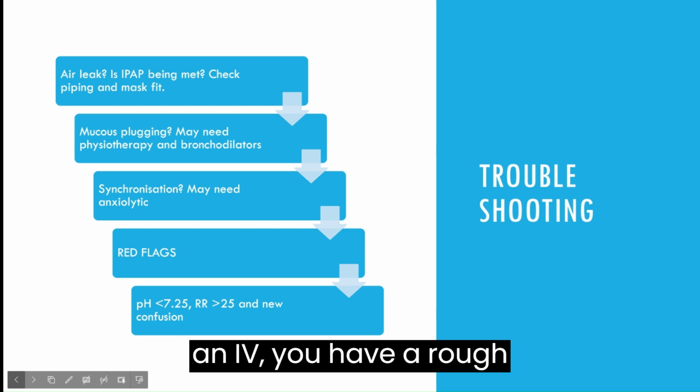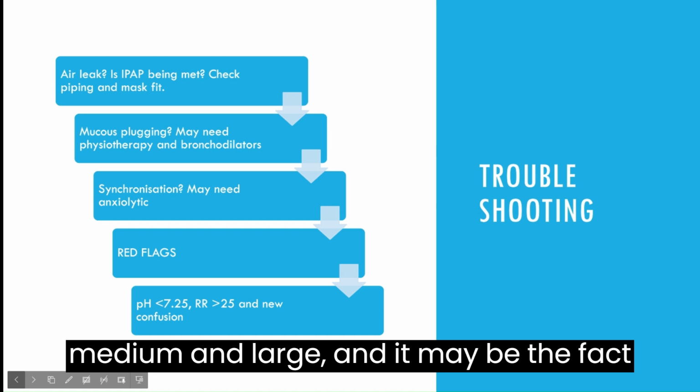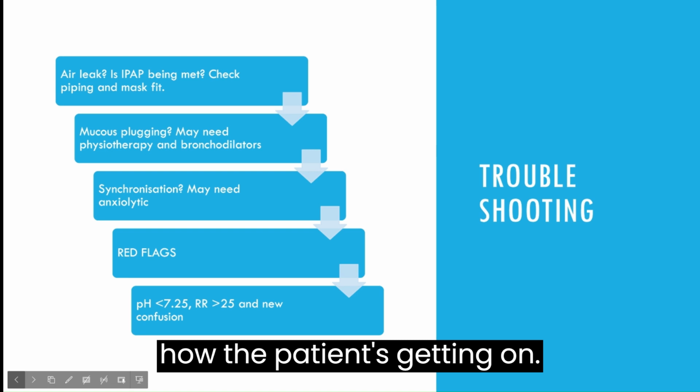When you first set up NIV, you have a rough idea of which mask to fit with small, medium and large, and it may be the fact that you actually might have to increase or decrease the mask size depending on how the patient's getting on.